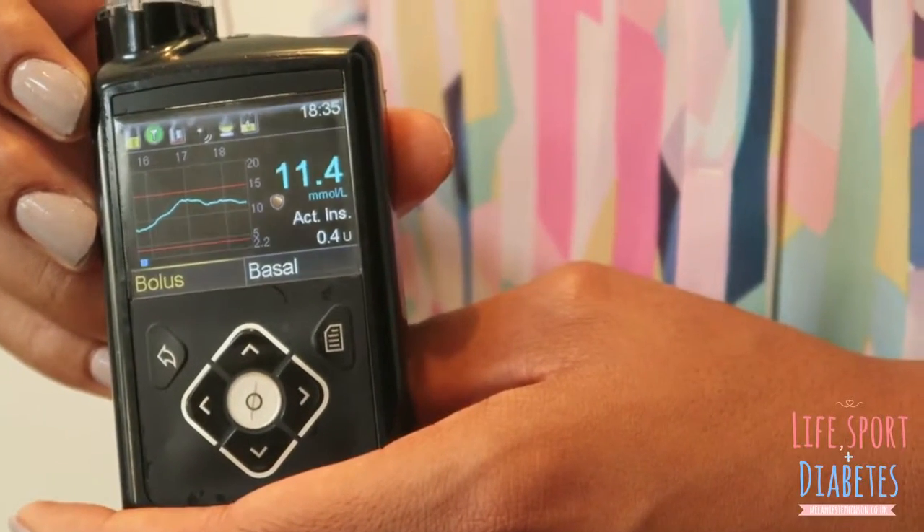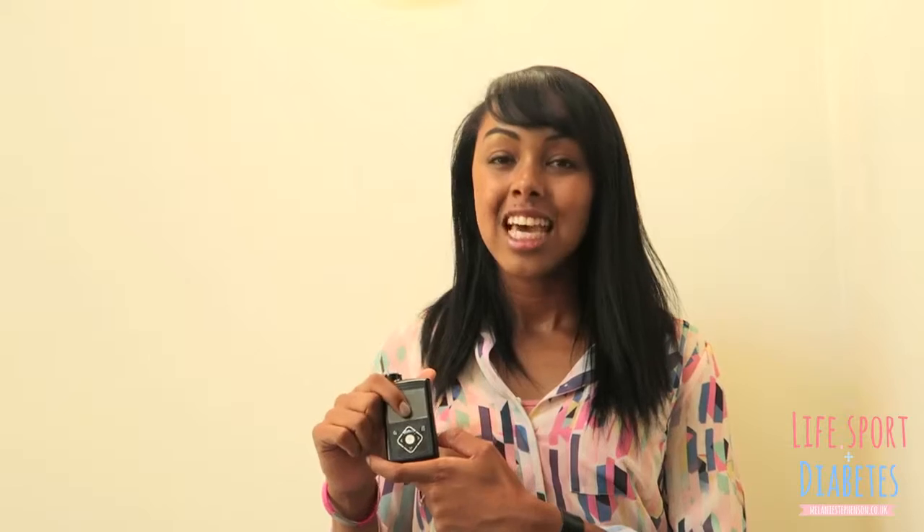This pump is the Medtronic MiniMed 640g. I've been trialling it for the last two weeks. I didn't want to do a blog straight away when I was getting to know the pump, because I wanted to understand it and for my body to get to know it before I could give a true reflection on what it's been like.